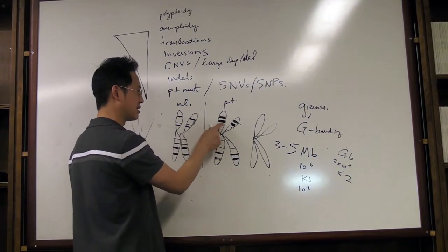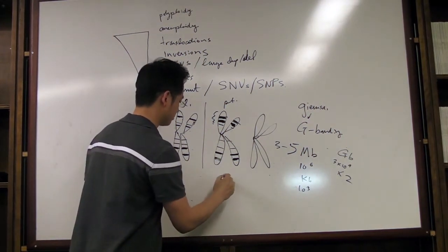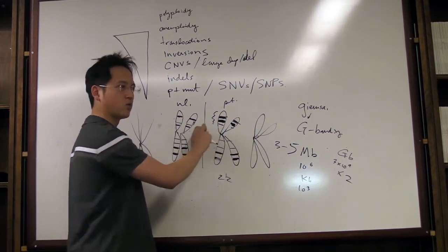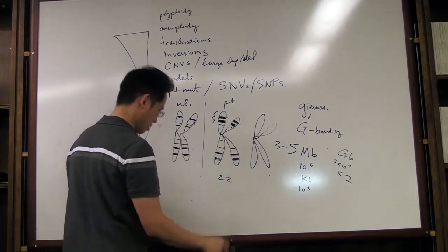And I recognize that this portion here is actually from chromosome 11. But this is chromosome, I don't know, 22 or something like that. Oh, there must be a rearrangement. So translocations are easily detected. And then the other thing is maybe you know it is this way.